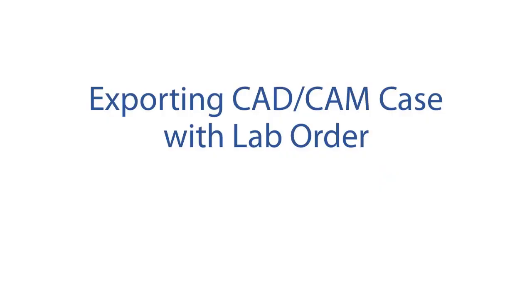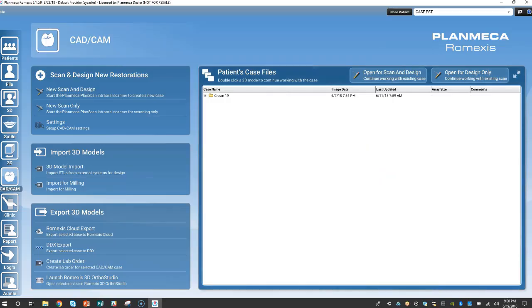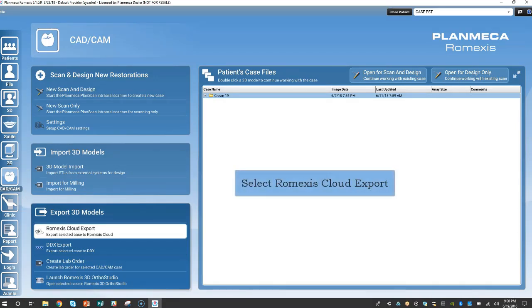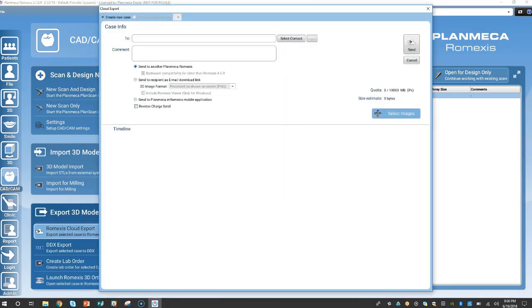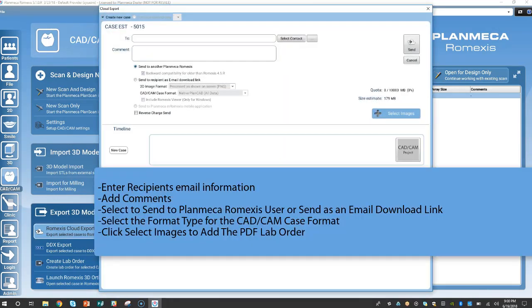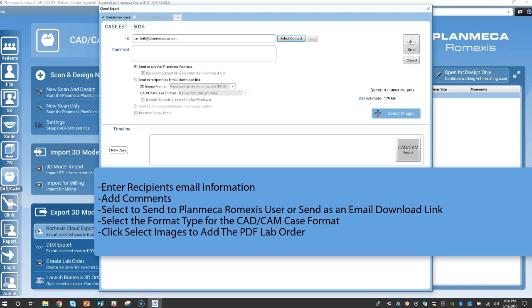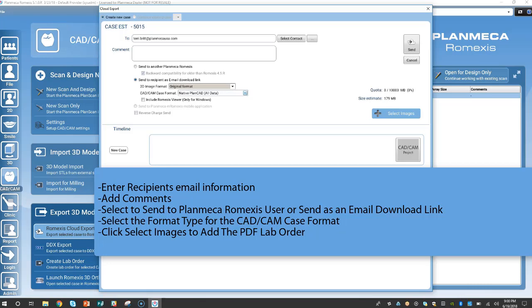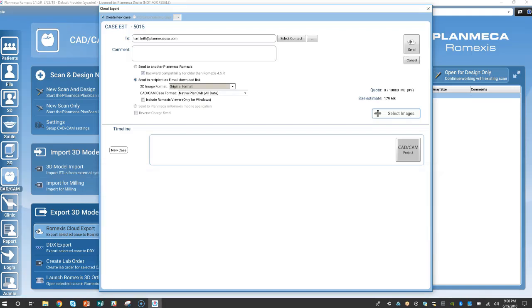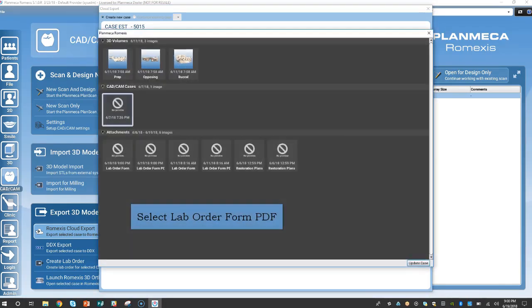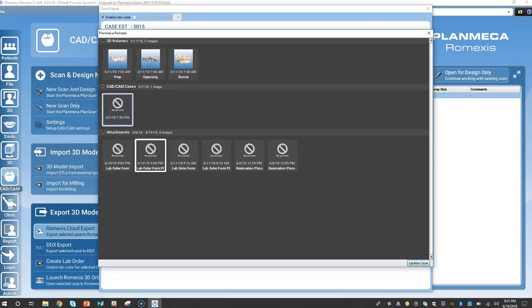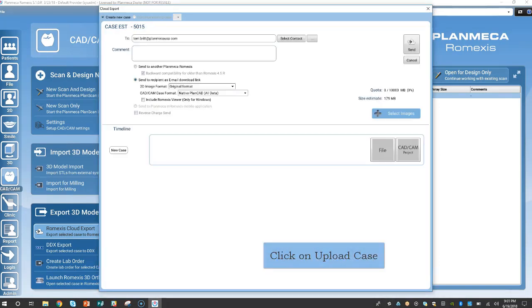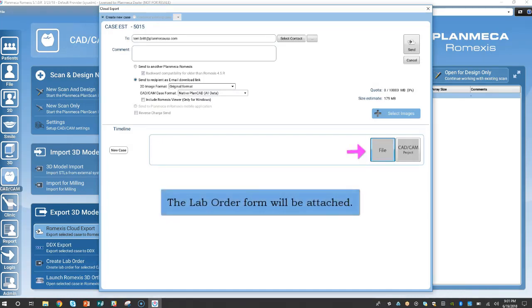Exporting the CAD-CAM case with lab order. Highlight your case. Select the Romexis Cloud export. Enter the recipient's email information. Add any comments. Select to send to the Planmeca Romexis user or send as an email download link to the non-Romexis user. Select the format type of the CAD-CAM case. Click select images. Select the lab order form PDF. Click on upload case. Here you'll see the PDF and the CAD-CAM order.